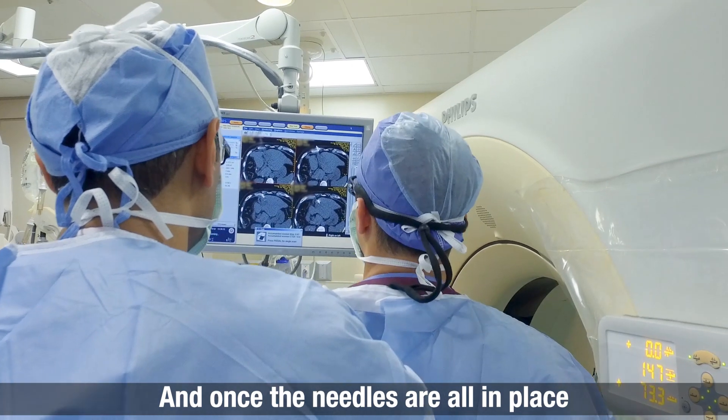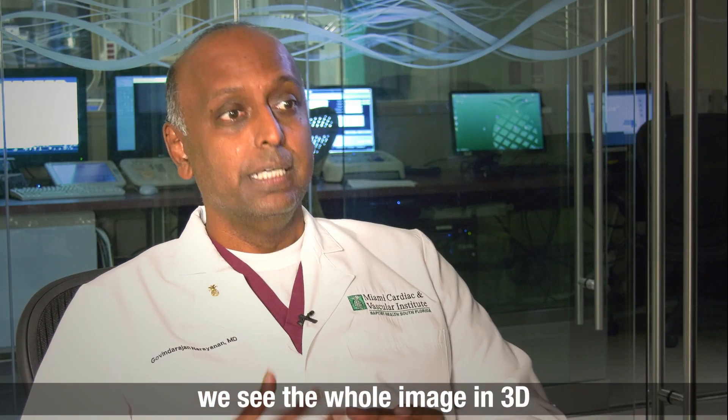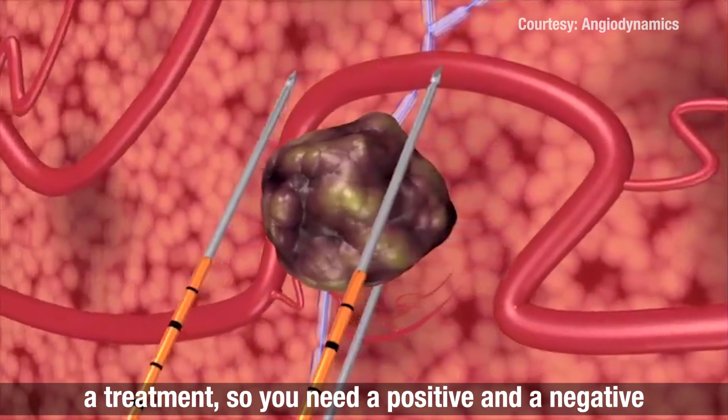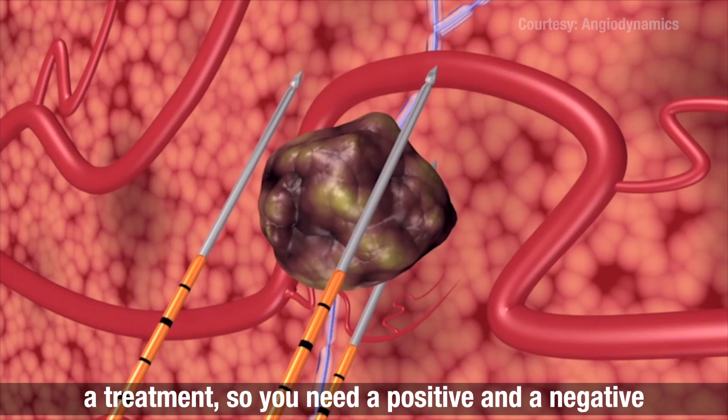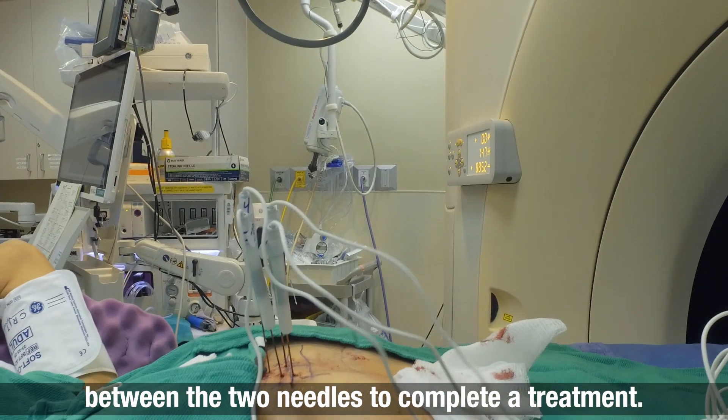Once the needles are all in place, we do what we call a 3D reconstruction — we see the whole image in 3D. Typically you need at least two needles to perform a treatment, a positive and a negative, and you need 70 pulses to be delivered between the two needles to complete a treatment.